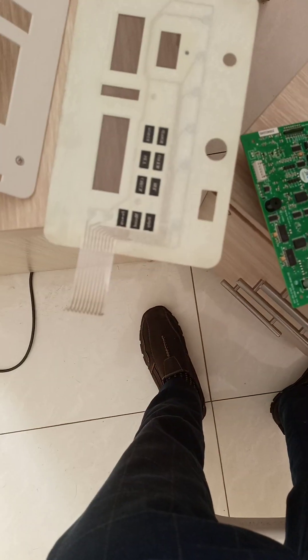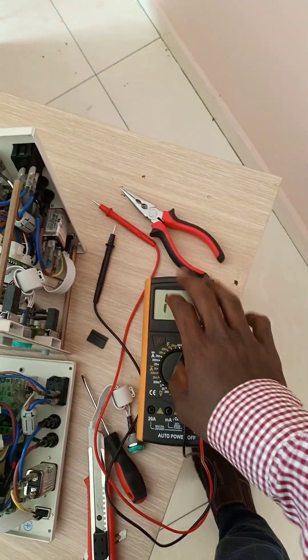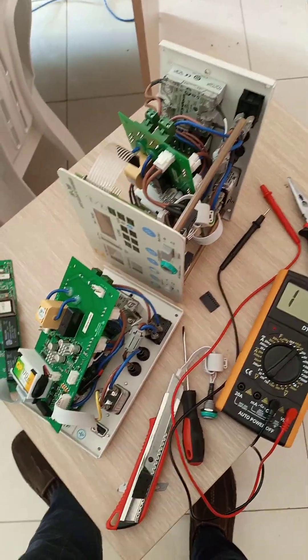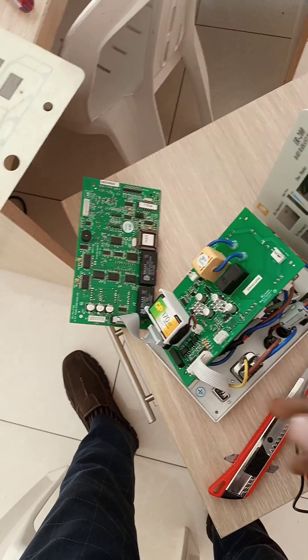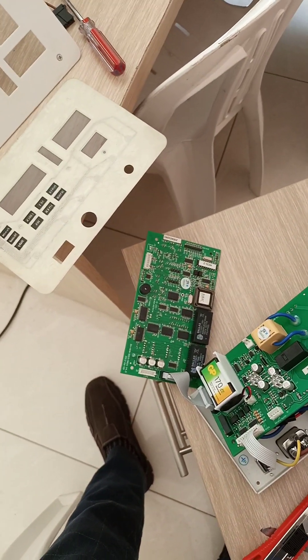Now when I measure the continuity between those last two cables, it gives no value, so I'm hoping the problem has been resolved. I'm going to reassemble everything, reconnect it all, and test the machine.